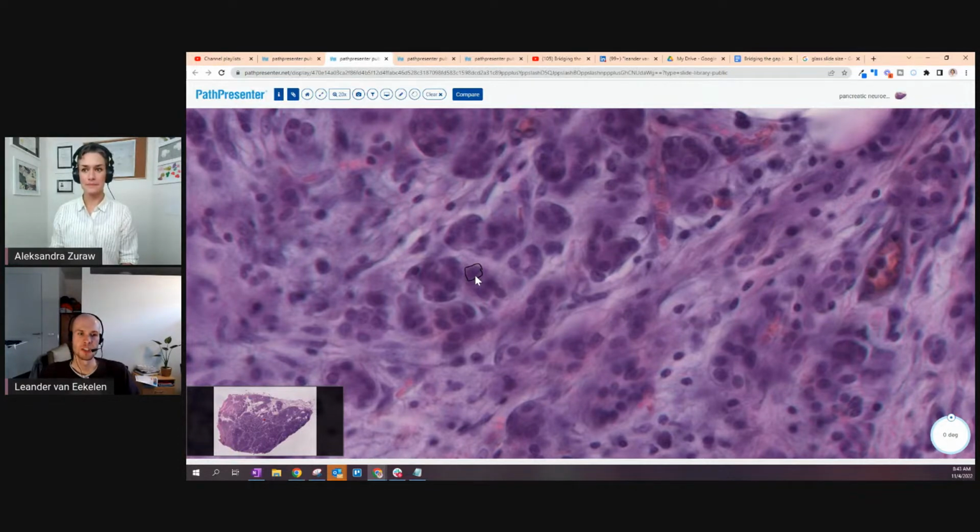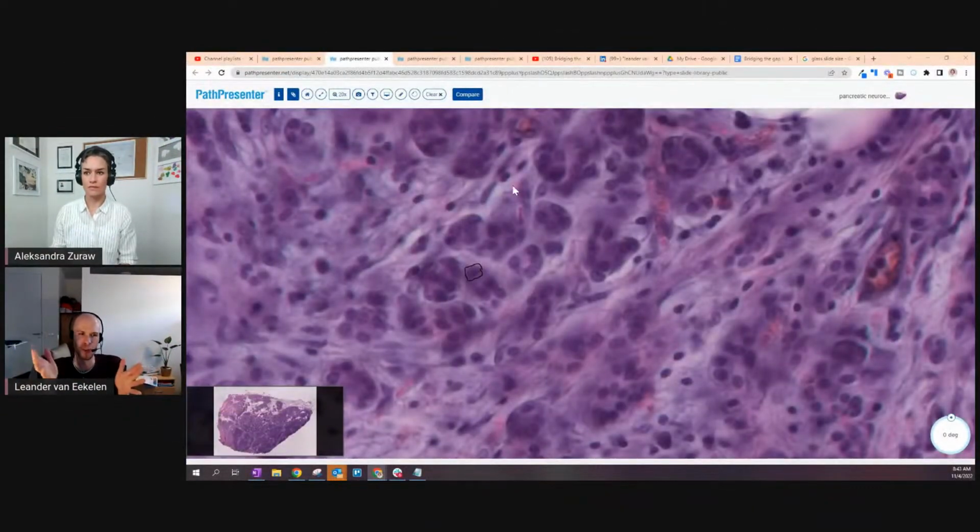So there's always a reason behind why you pick a certain task. For example, in my daily work, I want to be able to detect PD-L1 positive tumor cells. So that's an object detection task. I don't think you have a PD-L1 immunohistochemistry slide on hand. Doesn't really matter. I might look for it. Okay, go ahead. I'm interested specifically in the number of cells and where they are spatially related to each other. So I can solve that task by just doing object detection.